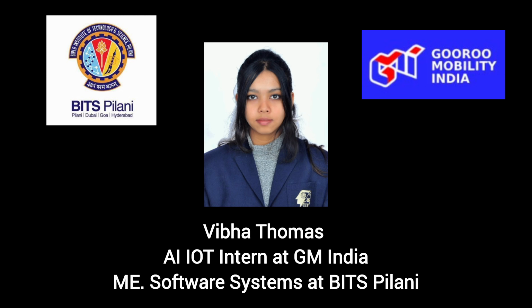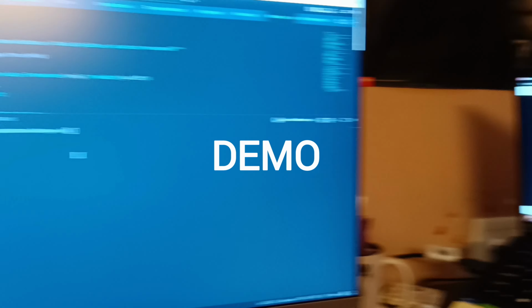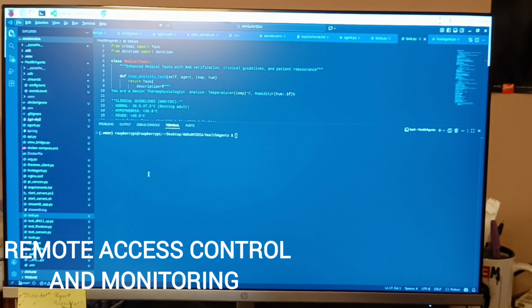Hi everyone, my name is Vibha Thomas and today I'll be demonstrating my project, which is Smart Wearable Textile Platform for Health Monitoring. Now these are the devices that I used for the project, and what I'm going to demonstrate now is remote access control from my laptop to the Raspberry Pi as shown in this video.